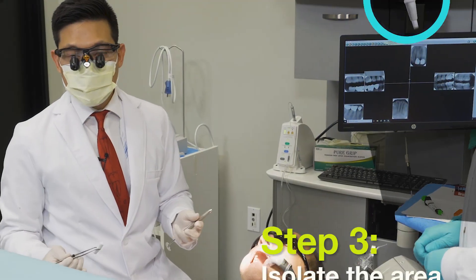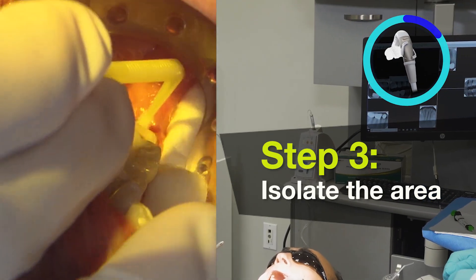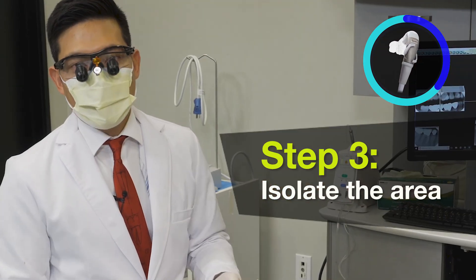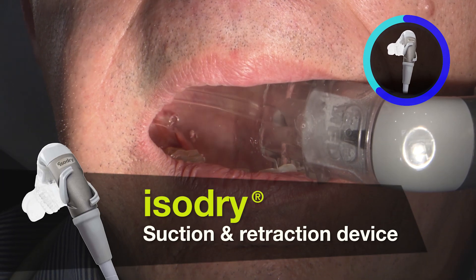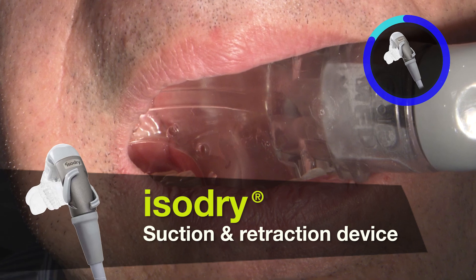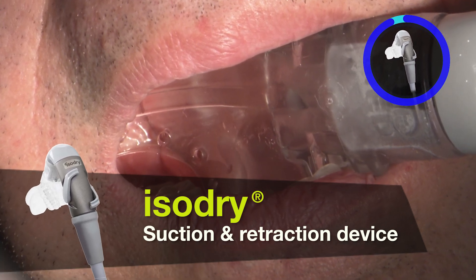Anytime we're cementing, particularly if we're bonding and following adhesive dentistry, we really want to make sure we isolate the area really well. We do have an iso-dry — it's a suction device and a retraction device to help keep the tongue and cheek out of the way, and it will suction any excess fluids.